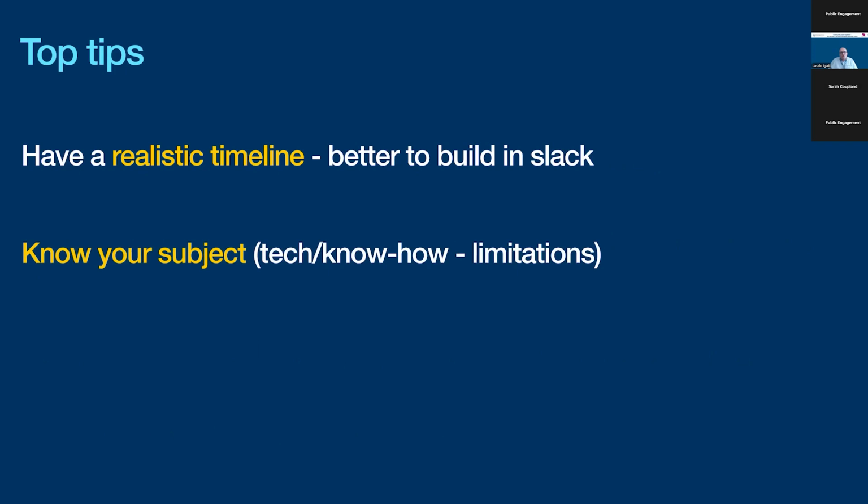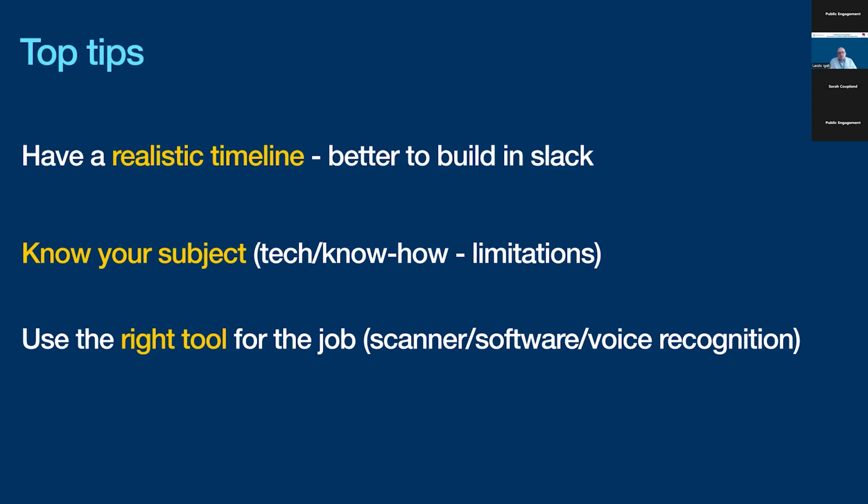You need to know the subject. I think that's probably a failure for me as well. I'm not knowing enough about digital networking in order to solve all of the issues. That's where our issues were, mostly with the implementation. Because if you don't know your limitations, you don't know the know-how behind everything, you are unable to converse with your IT department, who is going to be either your best friend or the staunchest enemies in this process.